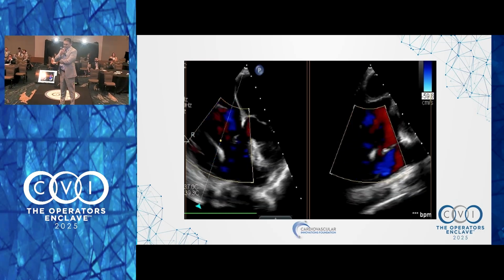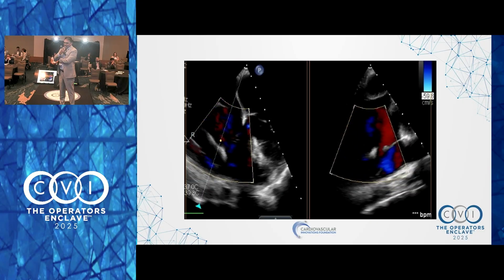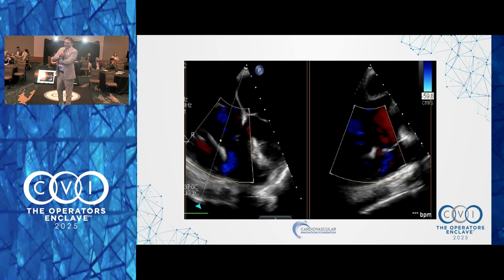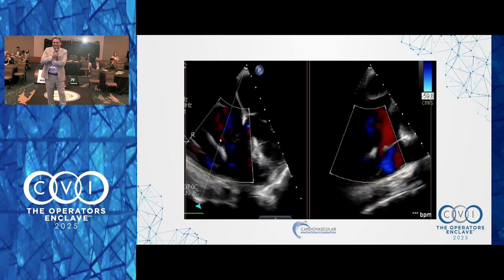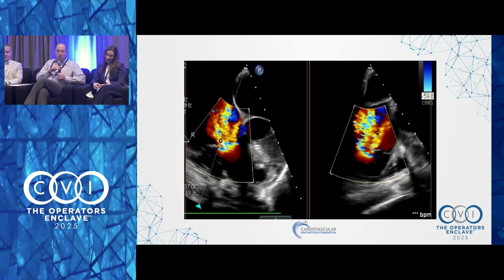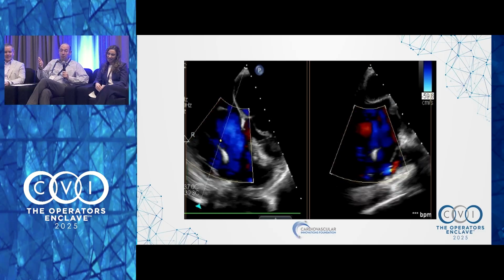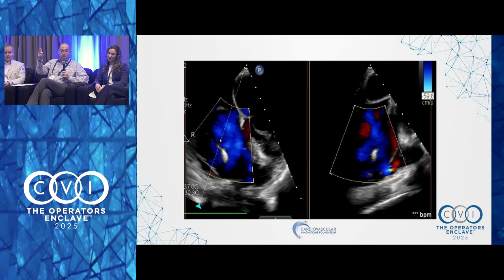I mean, I have to be careful what I say. I'm surrounded by two echocardiographers and two of the best interventionalists, and I'm going to take your stand on this. But this is difficult for the morning, Paul. You got to get us easier cases for the morning. I think what we have learned in the EP world, the two things I would like to know first are, one, how old is the lead? Two, how dependent is the patient?